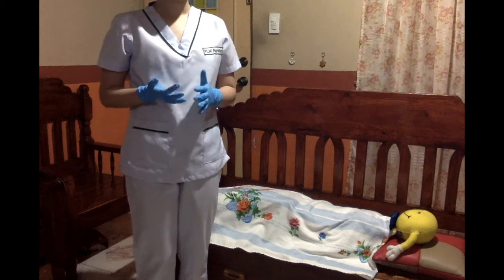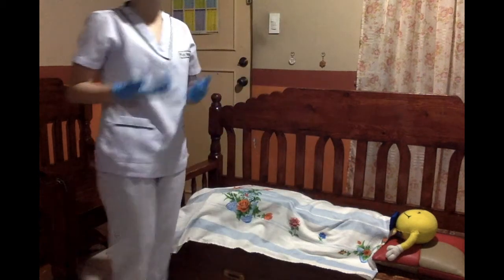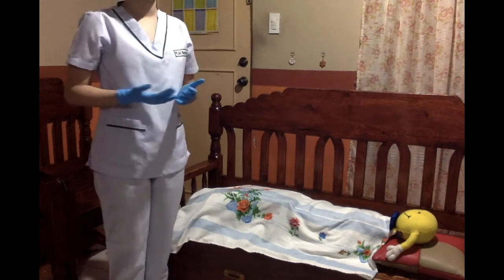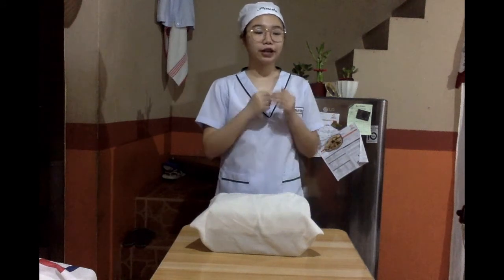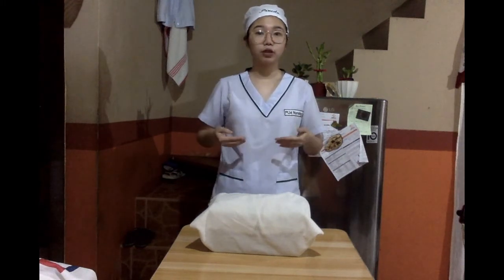But before that, I will lift the side rails to promote safety and make sure that the client is covered to reduce embarrassment. I would like to apologize first for my background. So this video is purely for demonstration purposes only. But in real life, the area should be spacious and far from contaminated objects. And this table should be at waist level to be considered as sterile.